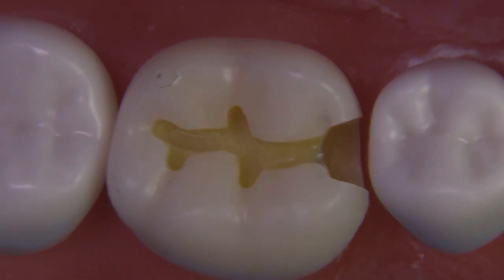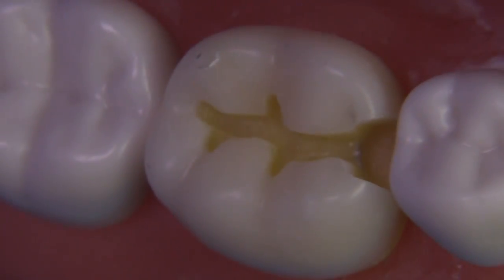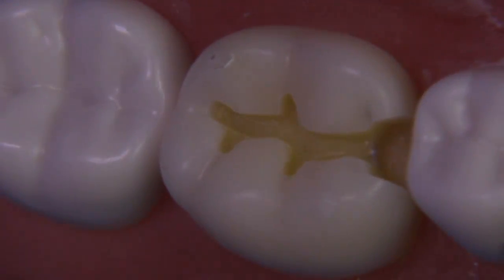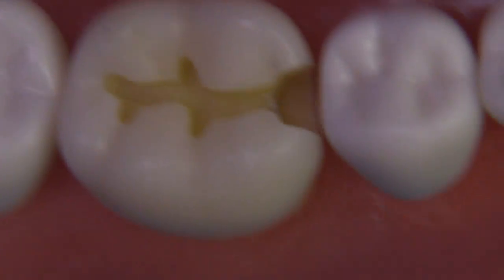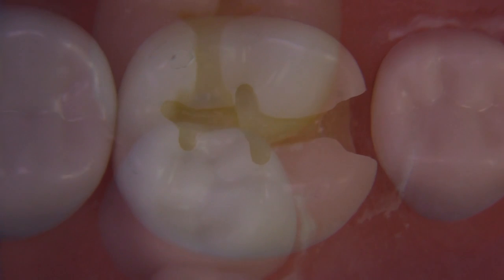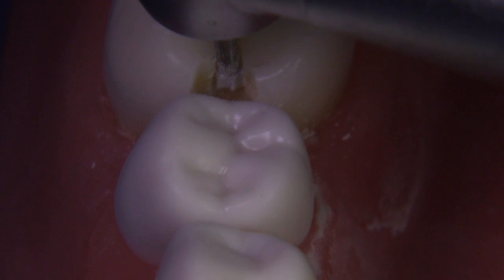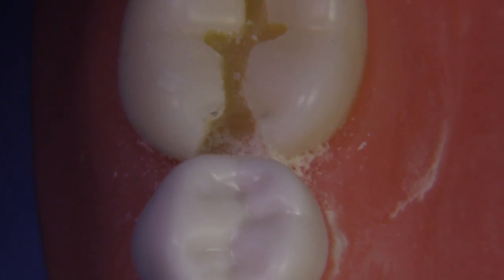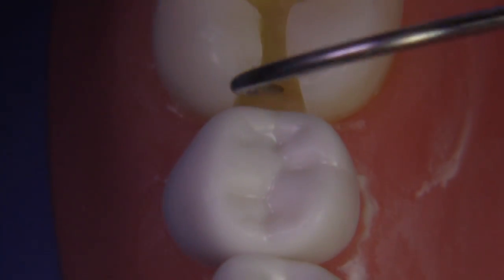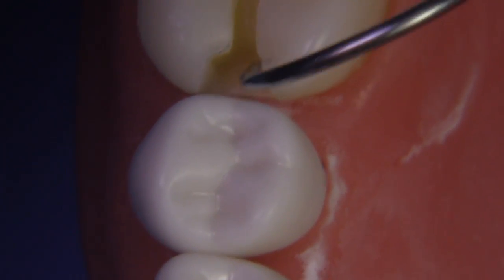Here we are now with the initial outline form. We need to work on that a little bit more and focus on the decay. If you're in an exam and need to make a request to remove caries, go ahead and do that. Otherwise, go ahead and remove the caries — you'll probably want to use a round bur for this. I'm going to use the number 4 round bur, which is pretty much the right size in slow speed for most conservative class 2s — not too large and not too small. Just by rotating the bur up against that axial wall briefly, you can remove the caries. Make sure it's tactilely gone and visually gone. If you leave decay behind, that will cause you to fail any examination.